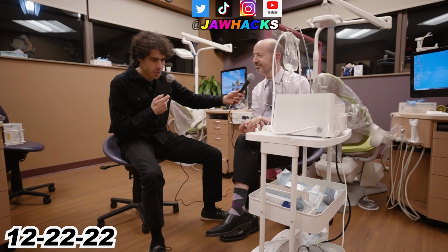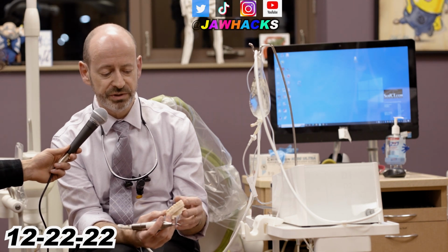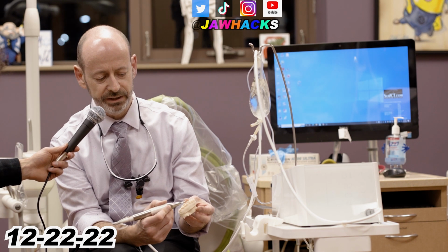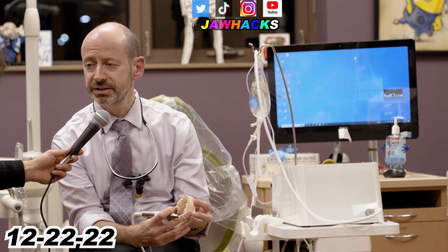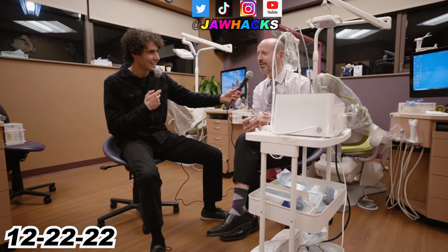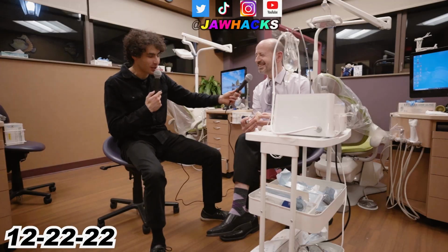Stupid question, but do you do this before you put the appliance in? Before. Yeah. So the procedure is patient gets in the chair, we numb the patient up, then I do the PIEZO, then we put a dressing. Once the dressing is in, then we insert the expander, and then we put the TADs. Wow. That's a long afternoon for that patient. It's about an hour and a half. So not too long. It gives me the heebie-jeebies just thinking about it.